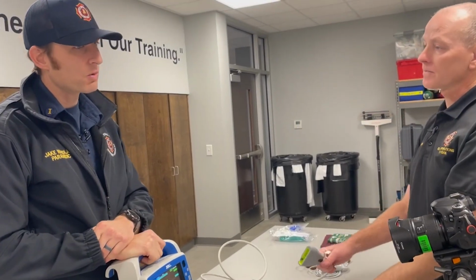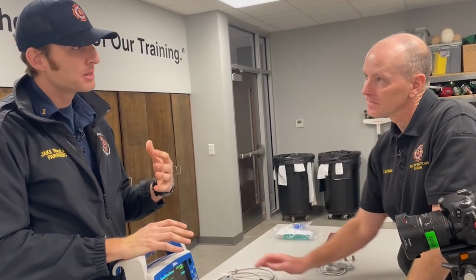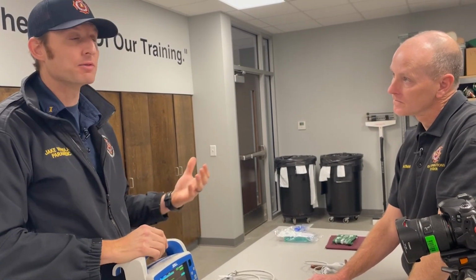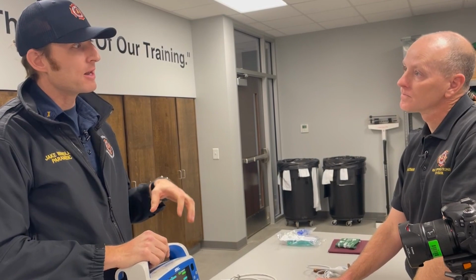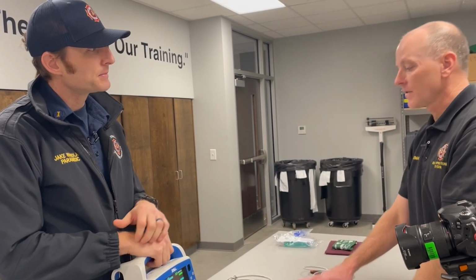Correct. Yeah, the way that those pads are designed, out of the manufacturer, they're designed to read body mass. So as long as everything's hooked up appropriately, you apply the pads appropriately, it's recognizing I have a smaller patient, I have a large patient. And it'll adjust the joulage accordingly to that size patient. But let's say they forget.